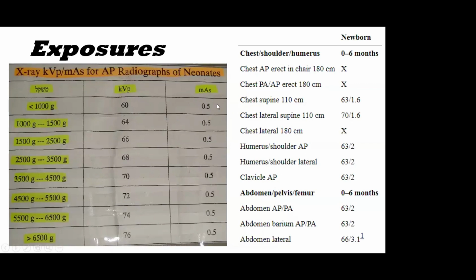So overall, if you want to try to do an X-ray on your own without the help of a technician, this is the kind of numbers you should remember.